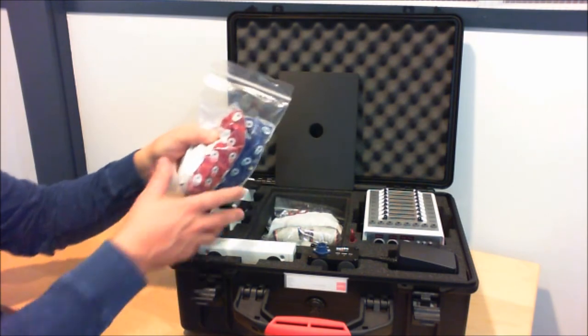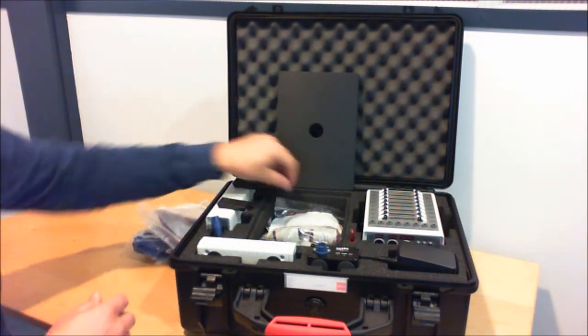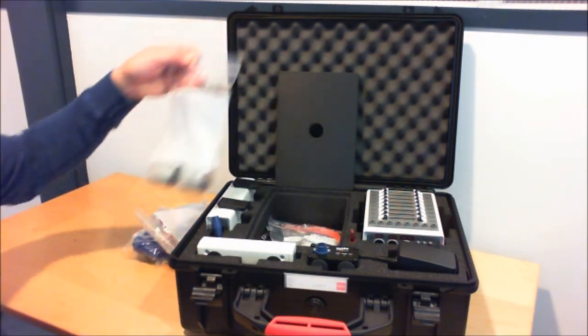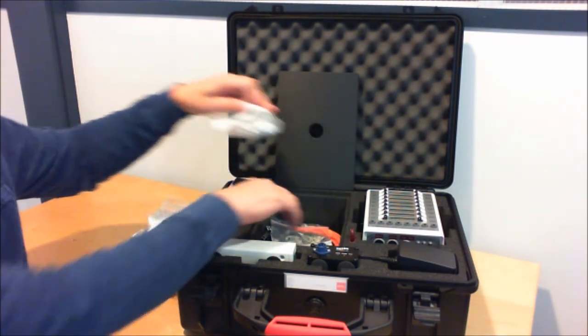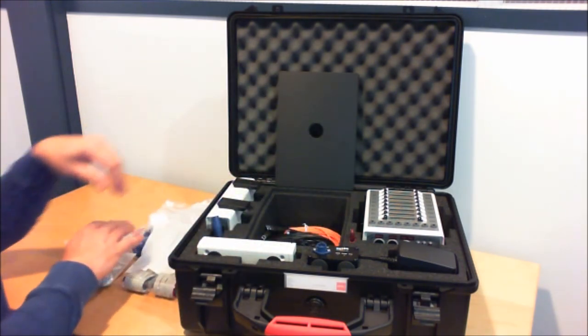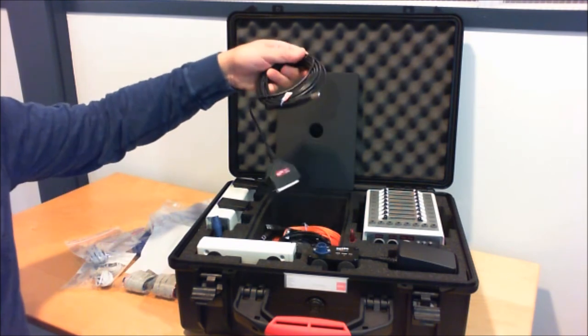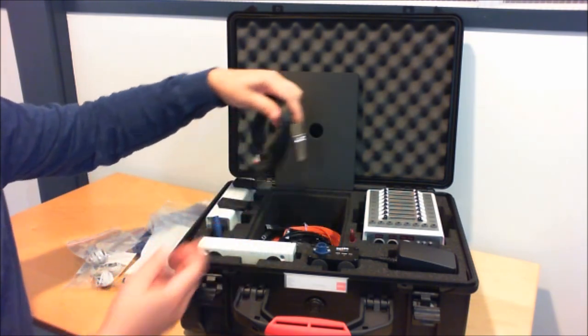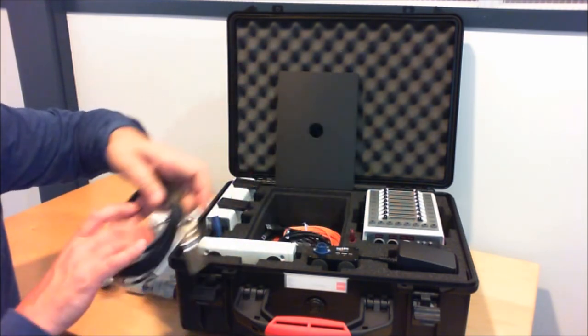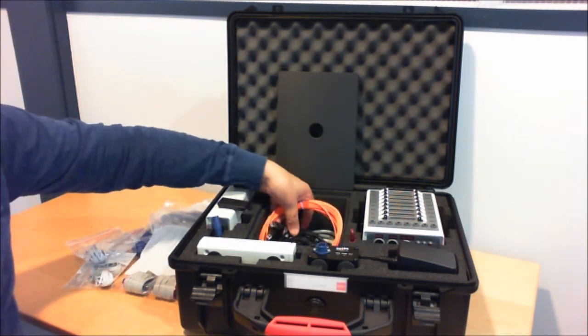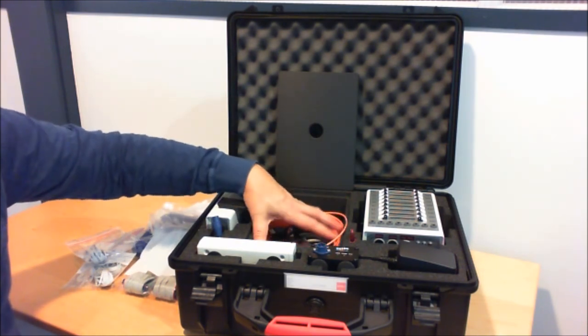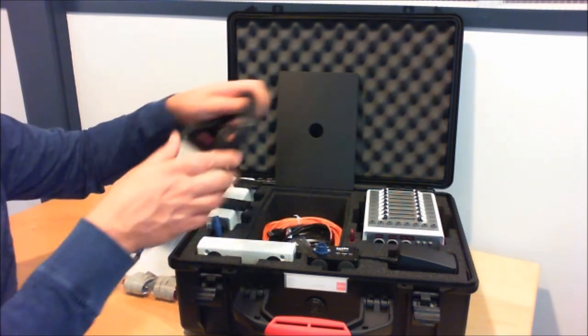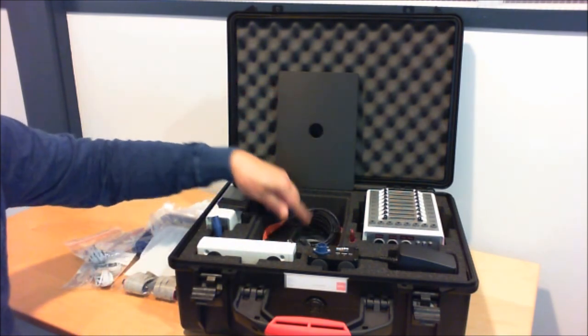In this case we have different size head caps, a 64 channel electrode set, CMS DRL flat type electrodes, and trigger cables. This is the USB trigger cable that comes standard with the system now. There are optical cables, USB cables for the optical receiver or USB interface, and another trigger cable as well.